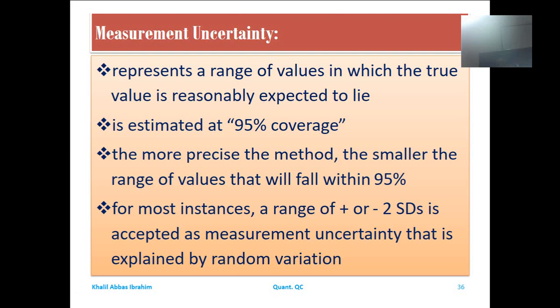It is just due to the random variation that we discussed before, and that is adopted by every analyst in health laboratories. This necessitates the acceptance of a range, specifically, scientifically and statistically calculated, and logically the true value is assumed to lie at one point, mostly in the center of that range, as we indicated by the bell shape.